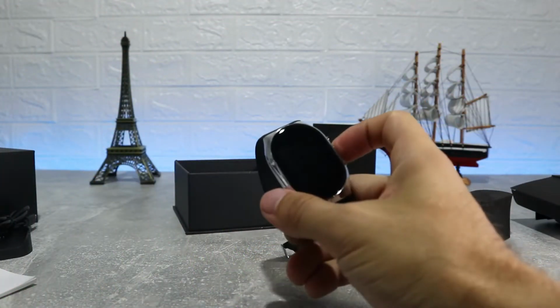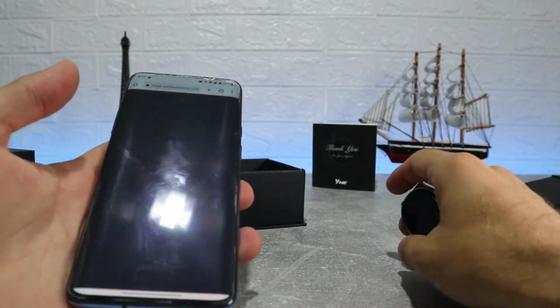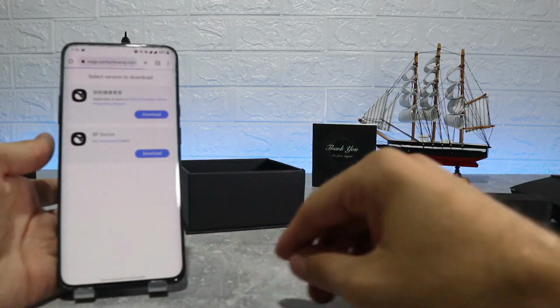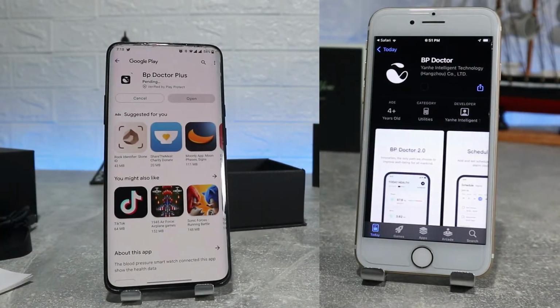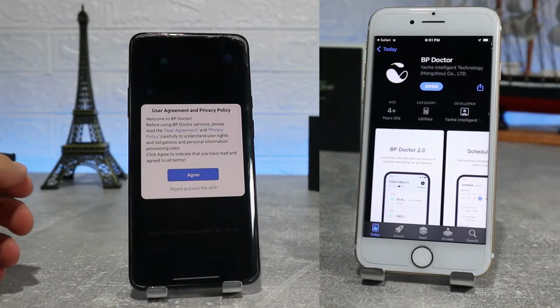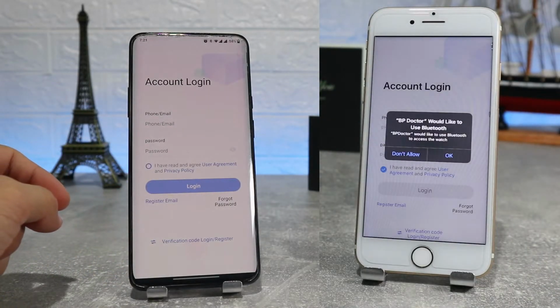Next, let's see how to connect our watch with Android and iOS smartphones. First, we will download the app BP Doctor Plus. So, what we're going to do now is take our phone and scan it. After we have scanned it, it will show us a link that sends us to the Play Store or App Store for iPhone. As you can see here, we already downloaded the app, and what we're going to do is go inside and see how to connect our watch.